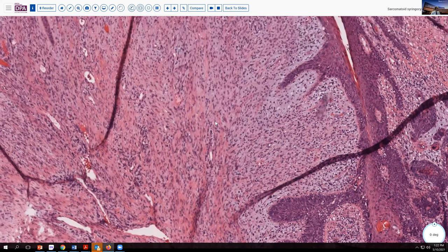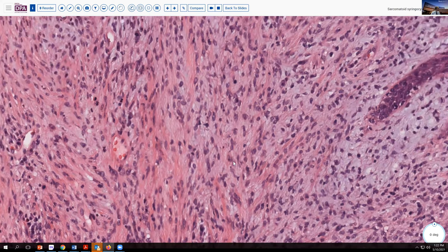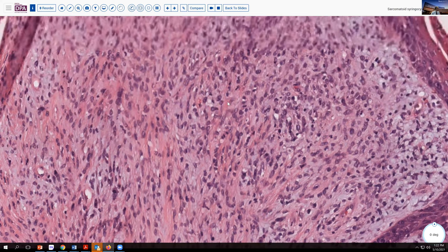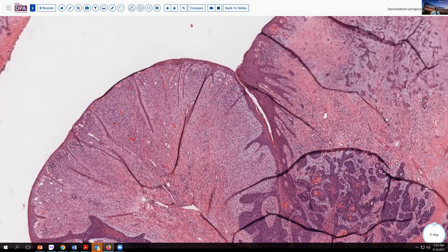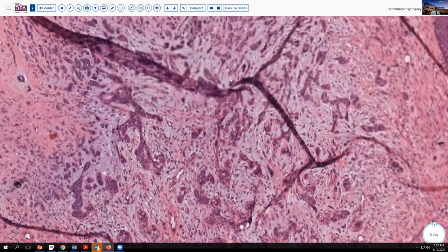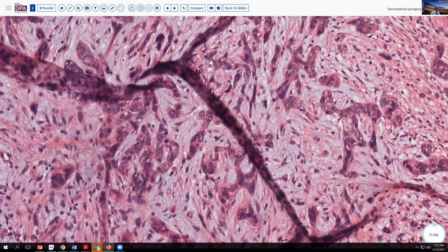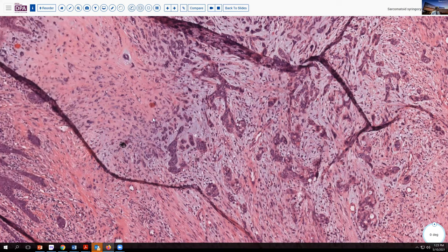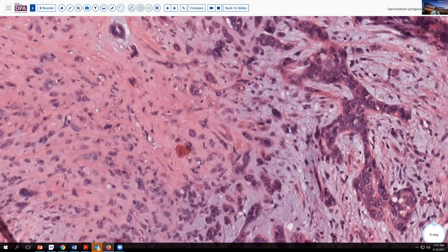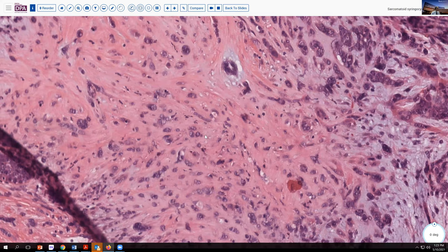And then look at this stroma, with sort of a myxoid appearance, very cellular, with a little bit of atypia in some of these cells — not just a bland background type of stroma. Here's another area, and we see an intermixed infiltrative, rather poorly differentiated pattern of cells. They look a little bit different from the more typical squamous areas, but they're associated with this transition to the stromal component. And so we might begin to think about an epithelial to mesenchymal transformation — a more characteristic sarcomatoid pattern or sarcomatous carcinoma that has developed in this particular area.